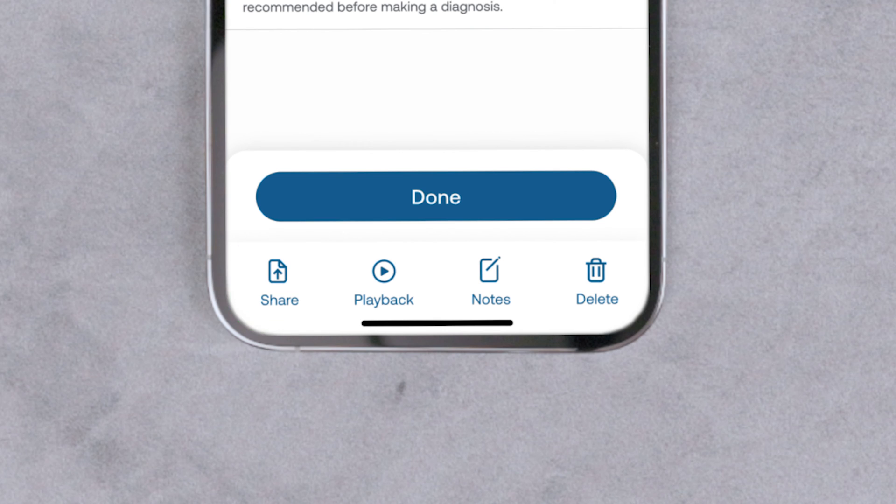You can export the recording via text message, email, or any other options on your mobile device.